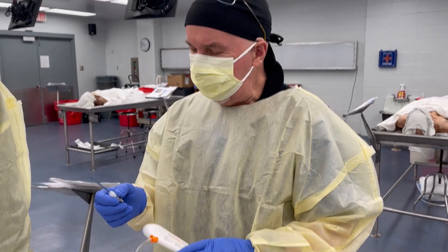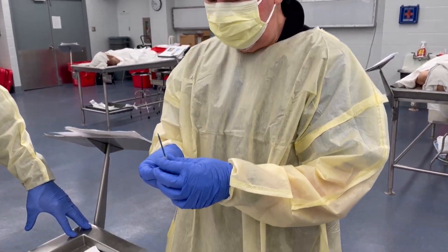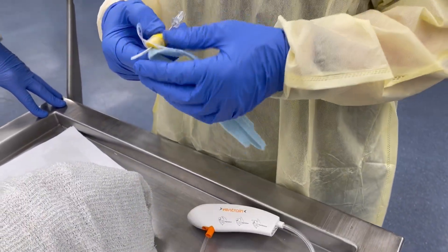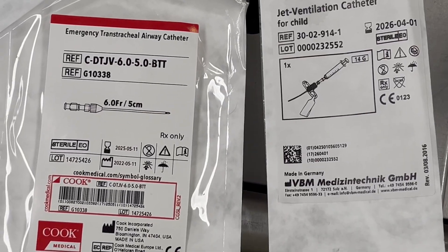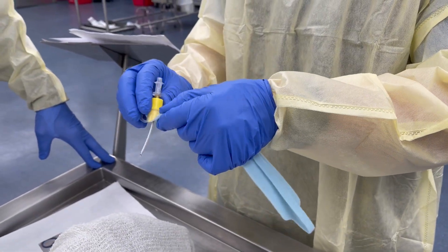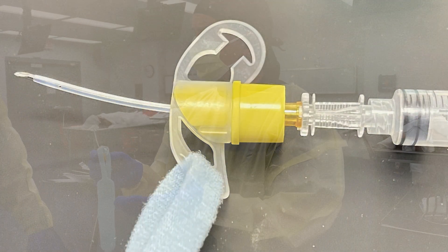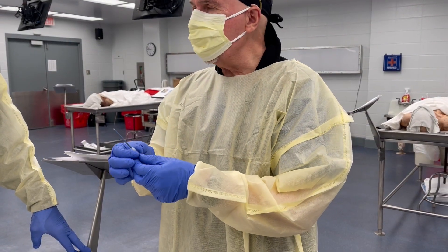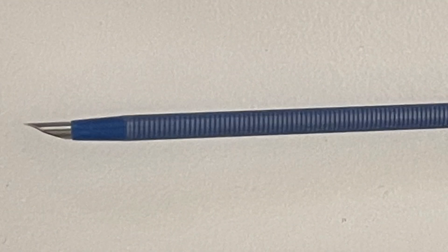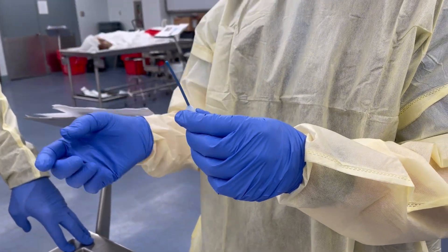I've got two needles. I have a Cooke transtracheal jet ventilation needle, and I have another needle — I don't remember the company exactly — but you can actually tie it onto the patient. This is a perfect size for a pediatric patient; this one is okay for a larger pediatric patient. The value of this one is that it's stiff — it won't bend. Most of these 14-gauge catheters that we use for transtracheal jet ventilation, they can.